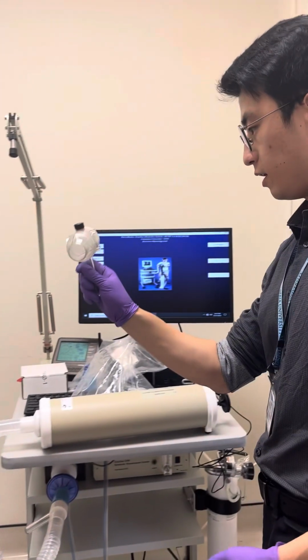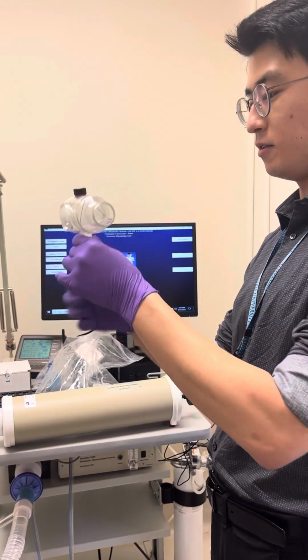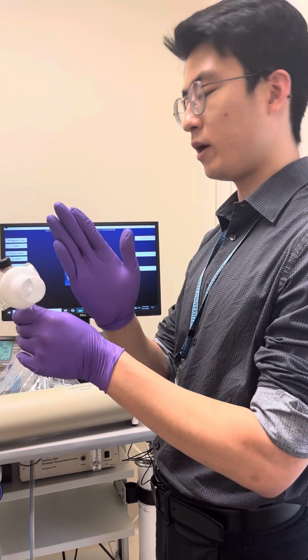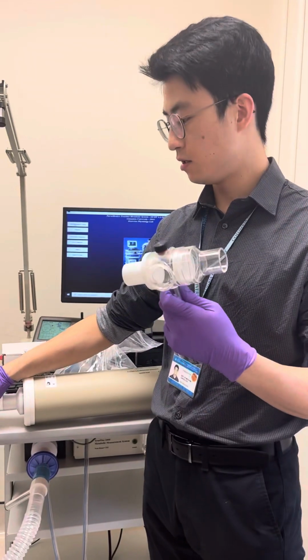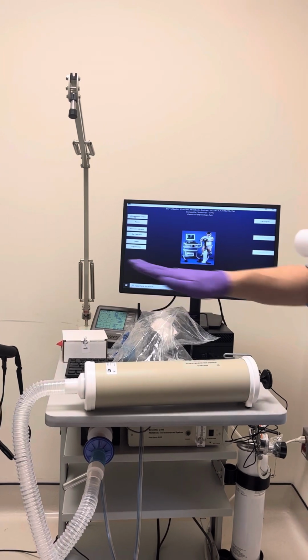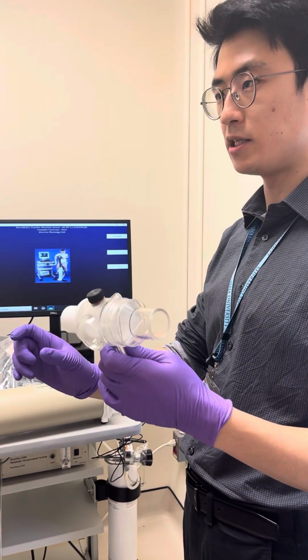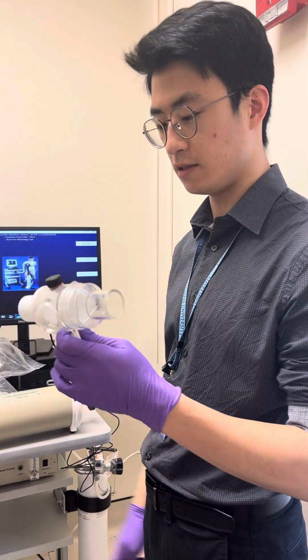So this is a two-way non-rebreathing valve. This right here is a spit trap, because when you breathe out, there's spit and then there's condensate, so this is what collects it. And then there's a valve here, where air comes in one way and then out another way. This end will be connected to the pneumotach, right? So this tube goes into the gas analyzer and the volume meter. And so it's going to measure the gas content of the breathing, as well as the rate and the depth of breathing. And the product is ventilation.